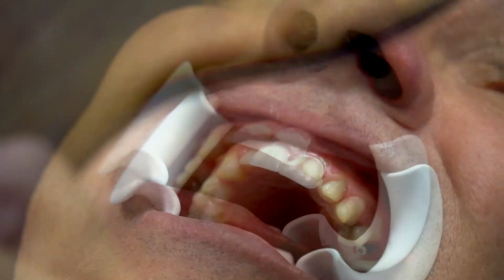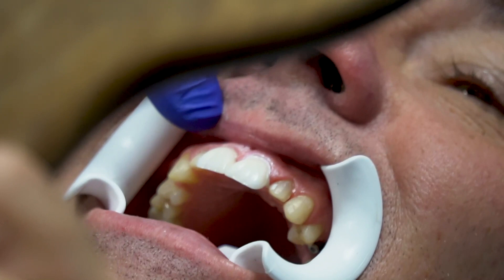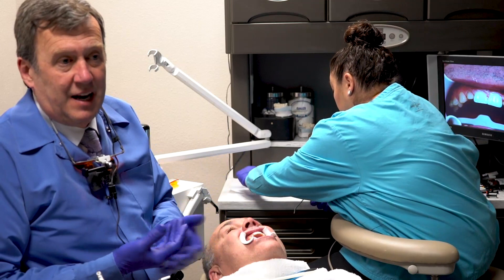Maybe just a hair lighter because it's more blocking out the incisal color. Looking at that, the right side is supposed to be slightly more opaque and the left side slightly more translucent. Obviously the more thick the porcelain gets, the less color influence you have. I could cement this anterior four with a clear and it's probably not going to affect the color much because it's a full prep case — at least the front four teeth are.